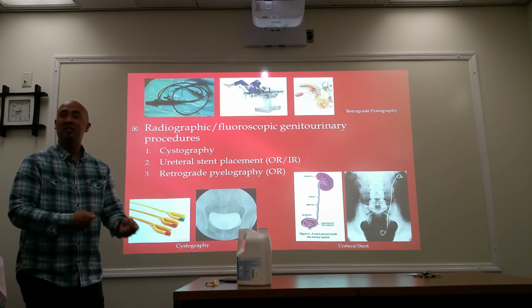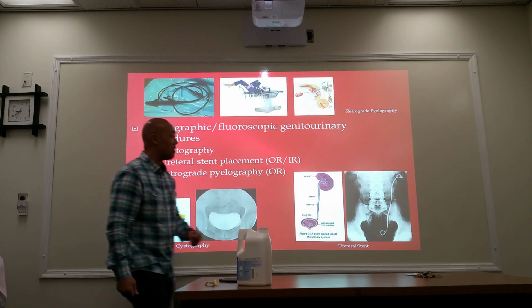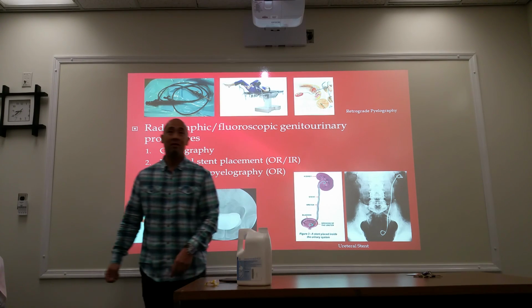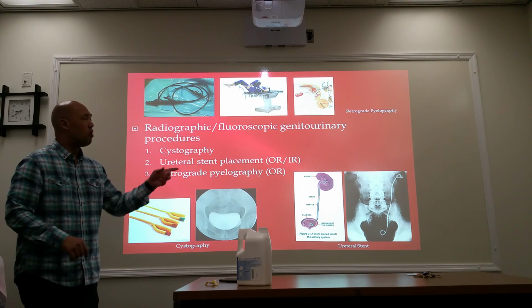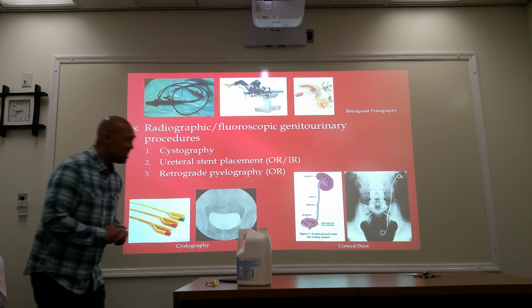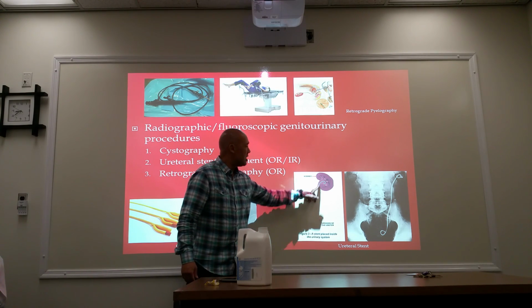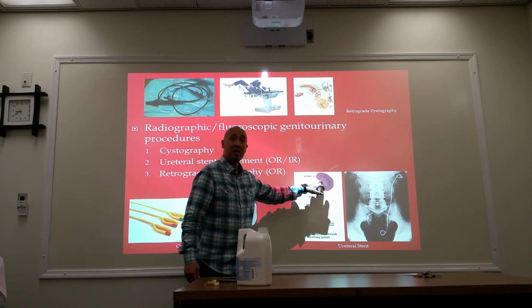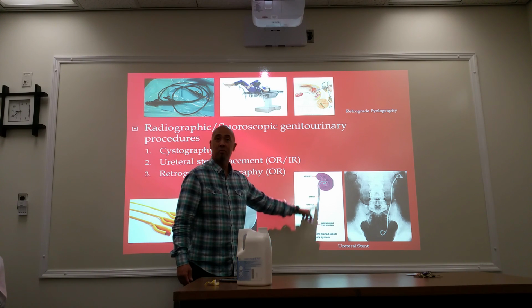And then we start putting wires and different gadgets in there to place the catheter at one end of the kidney and the other one down to the bladder. This procedure takes about maybe 15 to 20 minutes. The whole purpose of this stent is, if you have a blockage in your ureter, this plastic tubing will help empty the kidney of urine and into the bladder without any type of obstruction or blockage. It acts as a bypass.